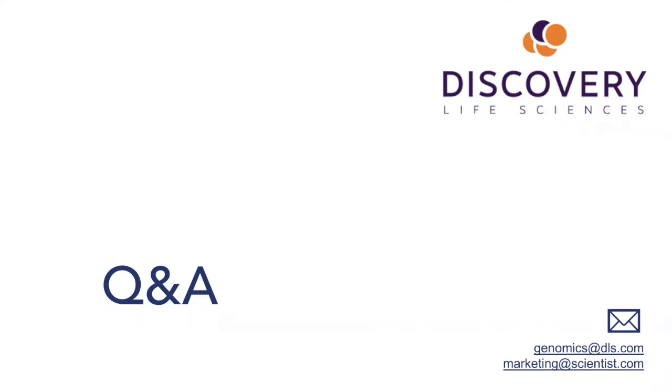Fantastic. Dr. Levy, is there anything you'd like to add? No, I think as Nipresh said, we find them to be pretty functionally equivalent, and I think the biggest item to look for, especially across a diversity of samples, is divergence from your typical observation. Divergence from the mean is the most important thing to look at on those profiles. Not necessarily exactly the slope of the line or precisely the height of the peak. I think there's a reasonable variance that can be observed there due to some of the differences in how those machines operate. But you just want to be sure you're comfortable with whatever QC mechanisms are being used so that it can be applied consistently.